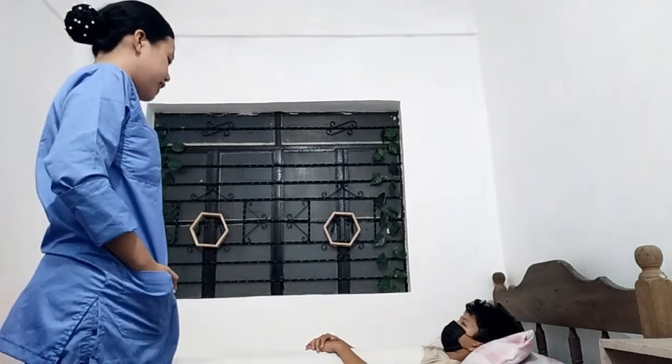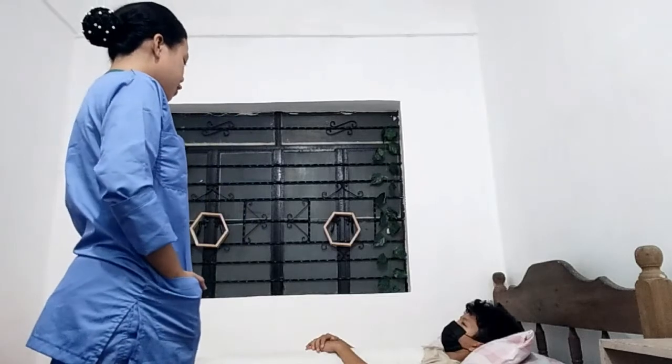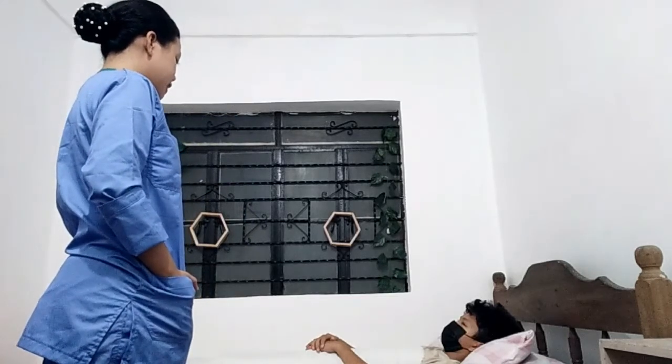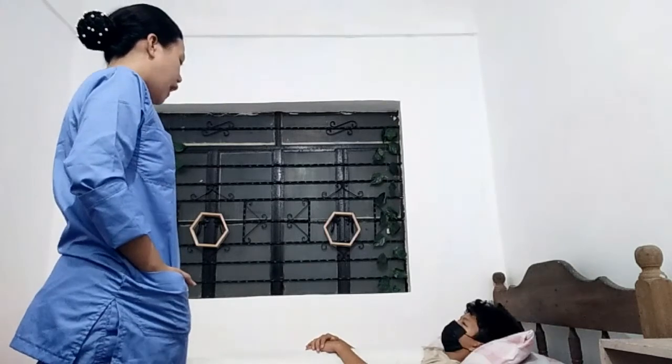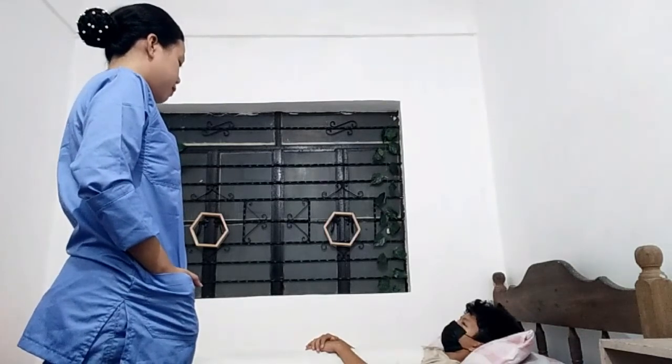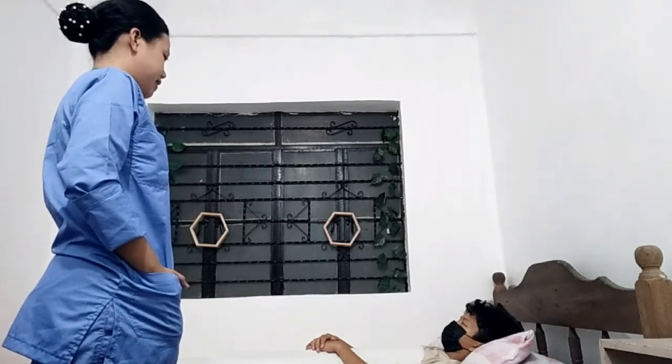I will check your medical records for irrigating prescription solution. Review medical records for signs and symptoms related to patient's open wound. Sir, do you feel any untoward signs and symptoms concerning your wounds? No. Okay. I will assess your wound site and please tell me if you feel any pain during the assessment.